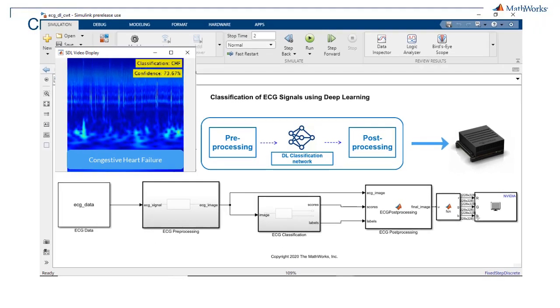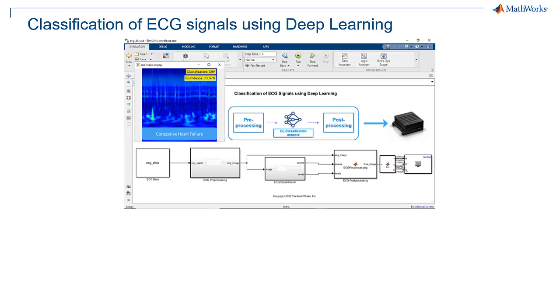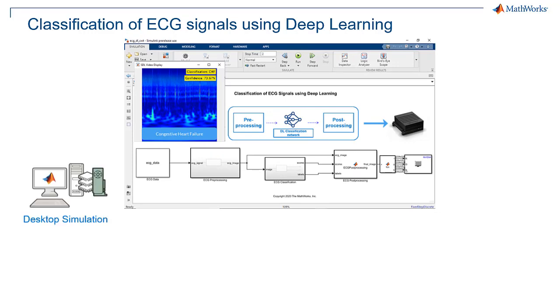The workflow for this example has four parts. First, we'll run desktop simulation on a CPU, then accelerate it using a desktop NVIDIA GPU.